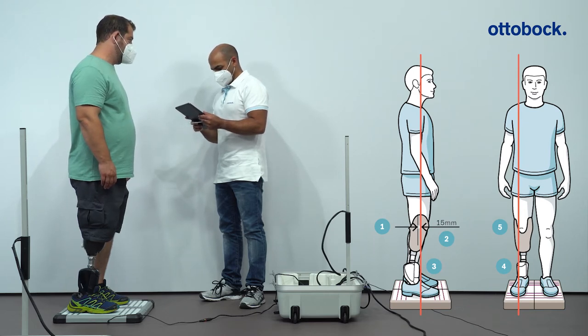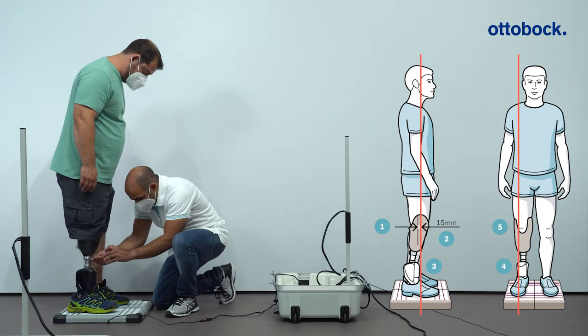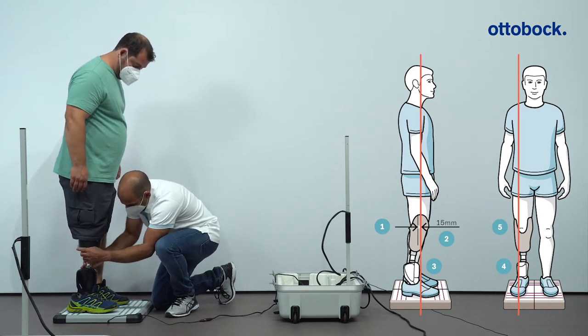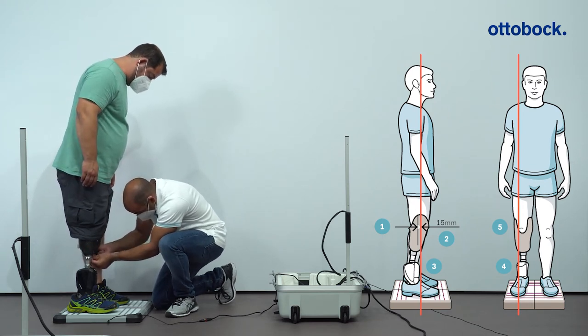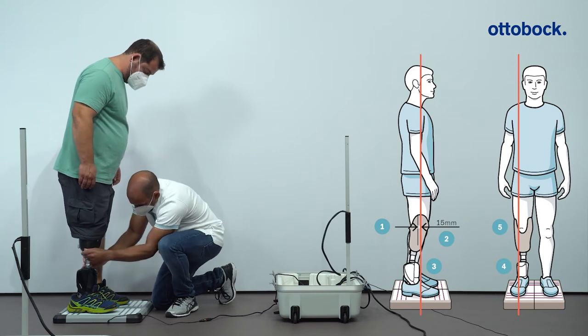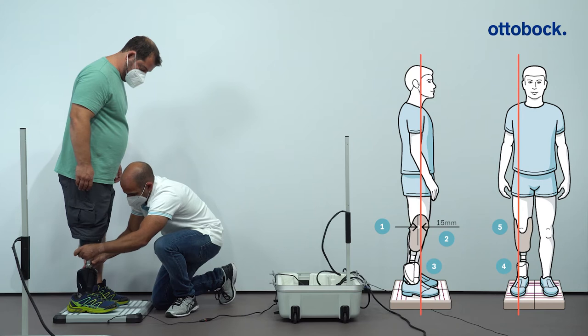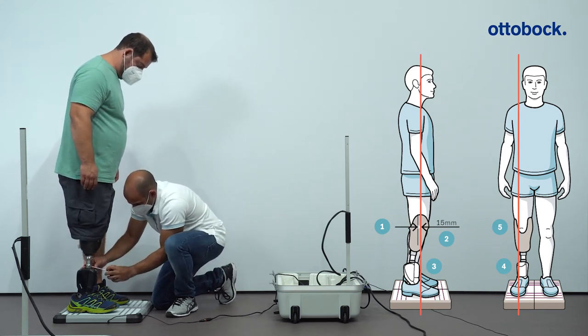Then make a second mark 15 millimeters anterior to the pivot point on the socket. Adjust the plantar flexion position of the prosthetic foot to ensure that the load line runs along the second anterior mark. Then move and/or pronate or supinate the prosthetic foot in a medial-lateral direction to ensure that the load line runs through the center of the prosthetic foot 50 millimeters in front of the foot adapter.